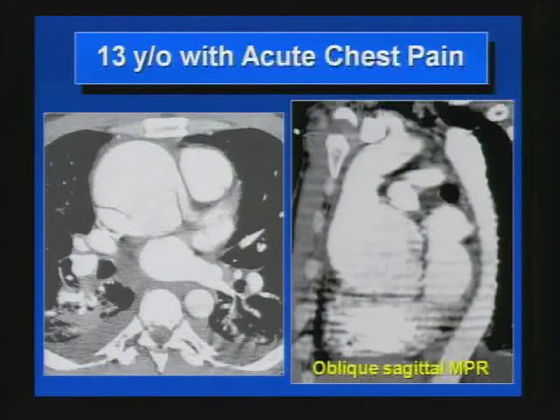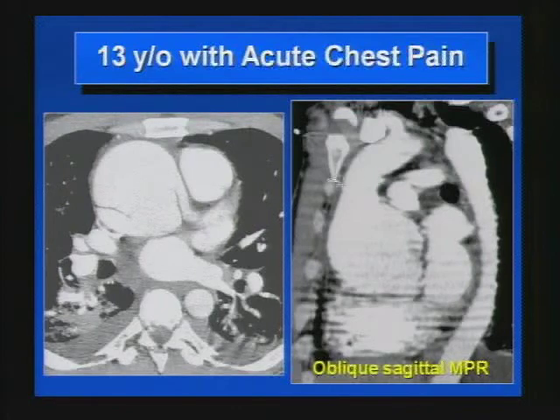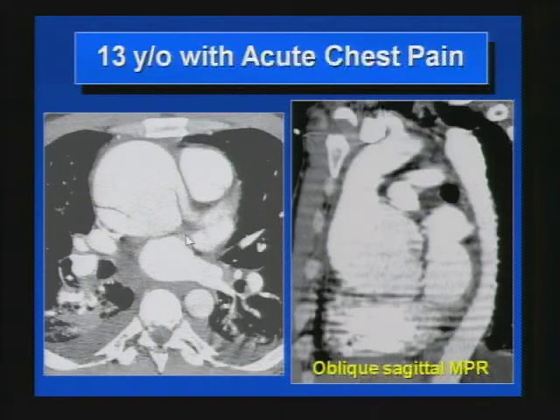Next patient: 13-year-old with acute chest pain. There are two things to identify: first, this huge dilatation of the sinus of Valsalva, and note that the aorta becomes normal in diameter above the sinotubular junction. At the level of the right pulmonary artery, the diameter is normal. This is consistent with annuloaortic ectasia. These patients are prone to dissection and rupture of the aorta. Here we can see an intimal flap at the level of the ascending aorta — type A dissection. The flap does not extend inside the left main coronary artery but does extend to the ostium.